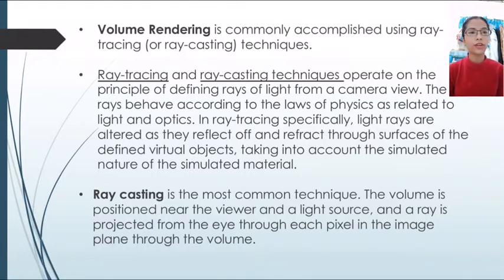Ray tracing and ray casting techniques operate on the principle of defining rays of light from a camera view. The rays behave according to the laws of physics as related to light and optics. In ray tracing specifically, light rays are altered as they reflect off and refract through surfaces of the defined virtual objects, taking into account the simulated nature of the material. Ray casting is the most common technique.